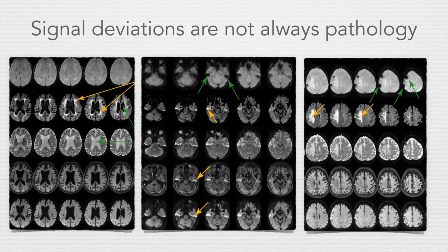And the geometric distortions around the ear canal should not be flagged either, so we haven't come to the point where we have confirmed that these are not causing a red flag or making a patient appear to have a lesion and so on.